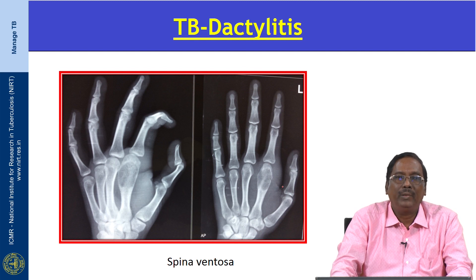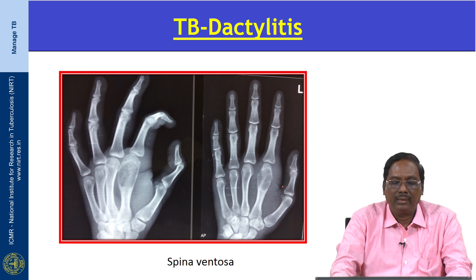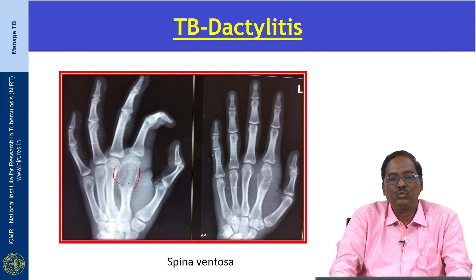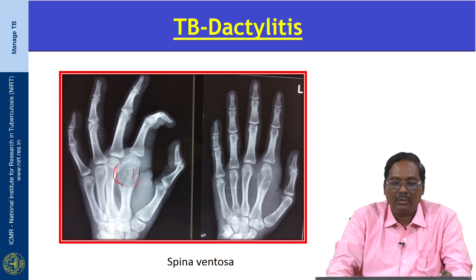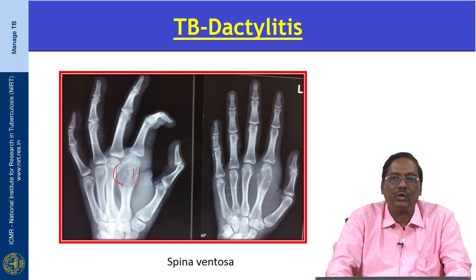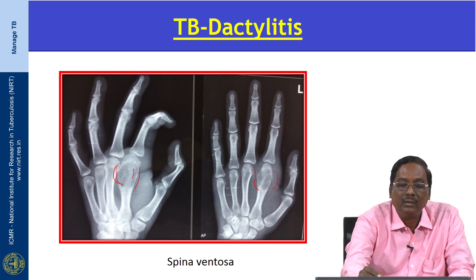This X-ray shows TB dactylitis, which is tuberculosis involvement of the short tubular bones of the hand and feet. It is more common in children. There is fusiform soft tissue swelling and periostitis. As the underlying bone is destroyed, a cyst-like cavity is formed and the remaining bone appears ballooned out. This appearance is termed spina ventosa — a globular soft tissue swelling with destruction of the periosteum.